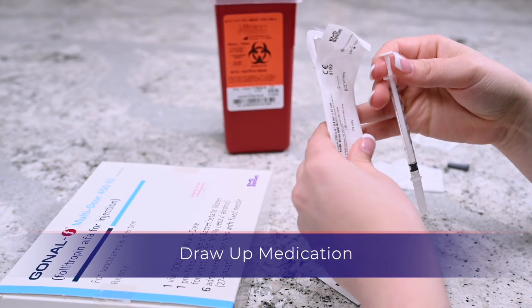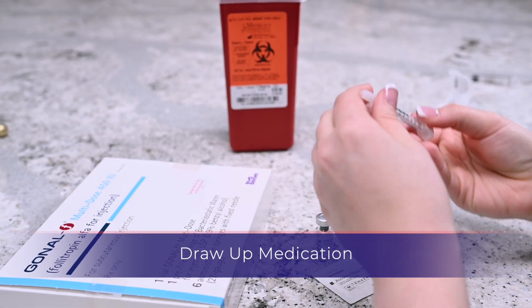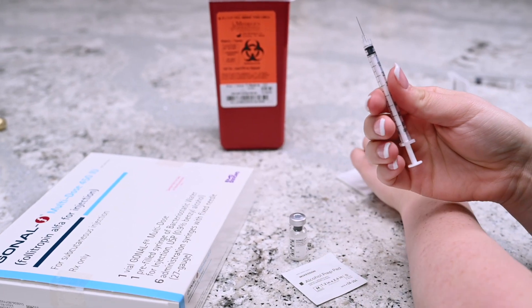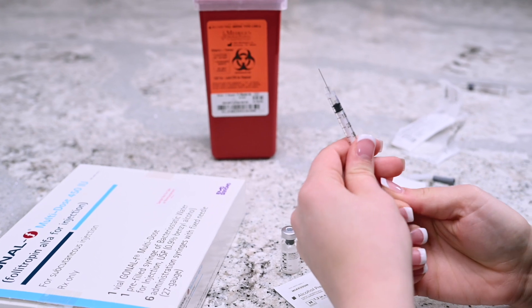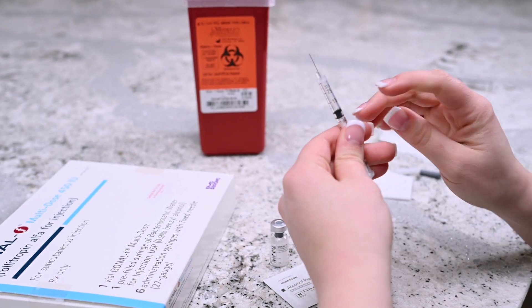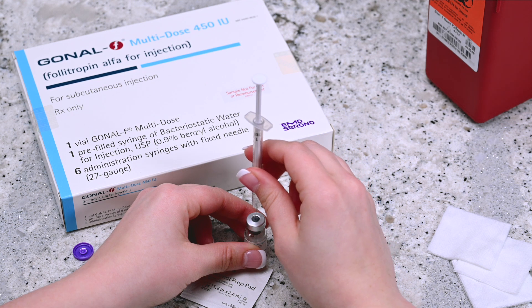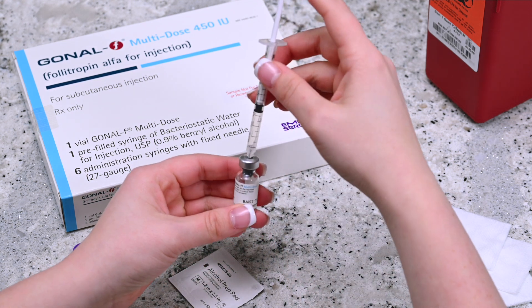Remove the custom dose injection syringe from its packaging and remove the cap. Hold the syringe upright and draw in the same amount of air as the dosage required — for example, 225 units. Insert the needle into the Gonal F multi-dose vial and push the plunger until all the air is inside the vial.